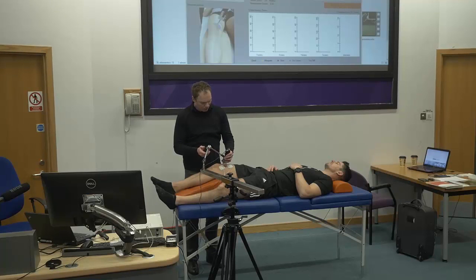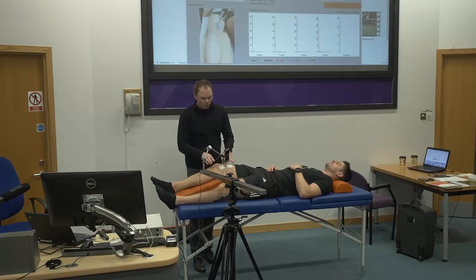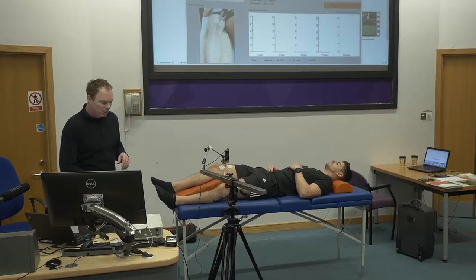Once you position the sensor, ask the subject not to move. A small movement won't affect everything, but a big movement — where the sensor goes to a completely different position — would obviously affect the result. Once you position this, you are ready to begin with the measurement.